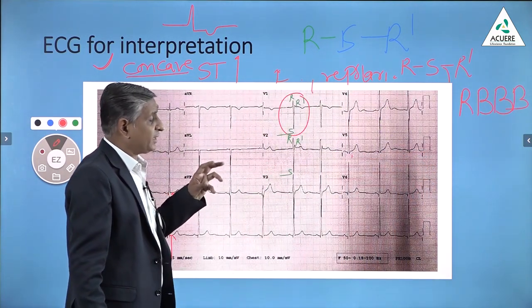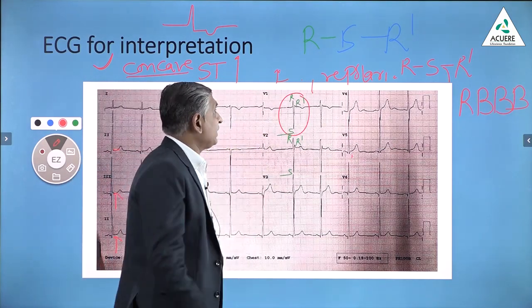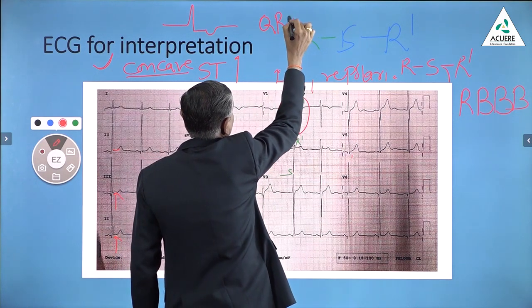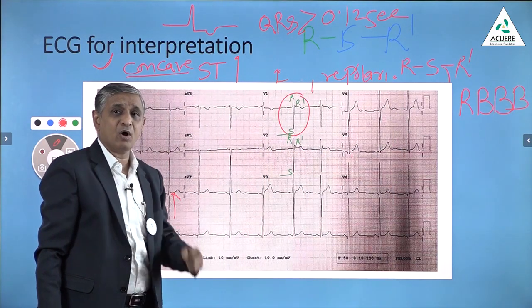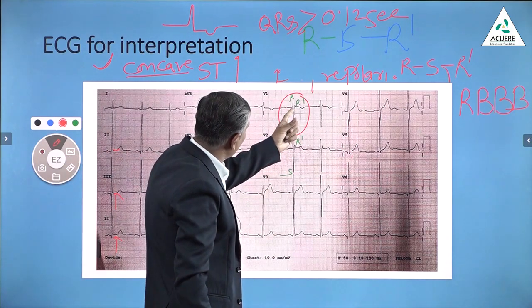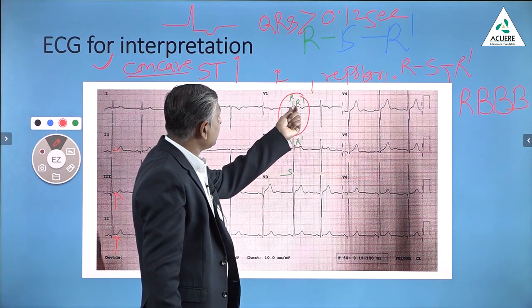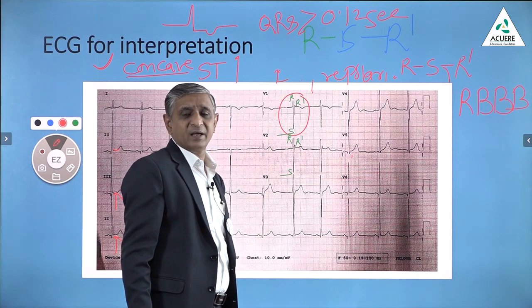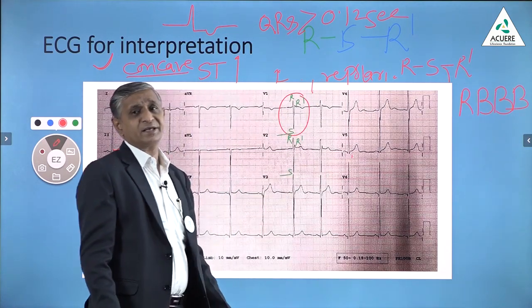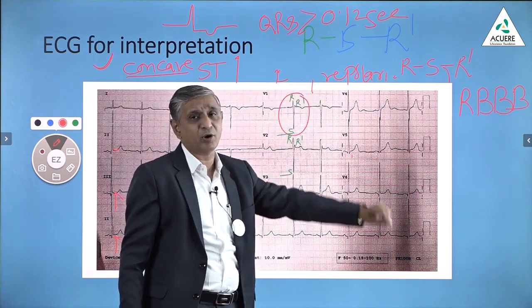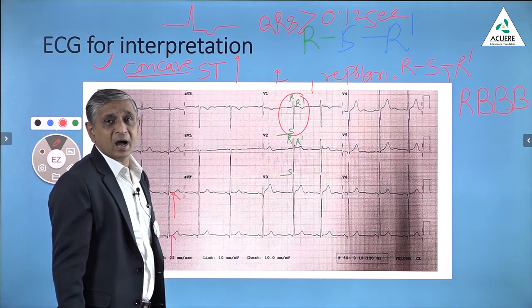Now a very important point: this is not complete RBBB because to define complete RBBB, the QRS duration should be greater than 0.12 seconds — that is, three small squares for the QRS complex. You can see that the QRS complex here is only one or one and a half small squares wide. And that's why this is incomplete RBBB. The R-S-R1 pattern is present, but the QRS complex is not wide enough to exceed 0.12 seconds, so we call it incomplete RBBB.